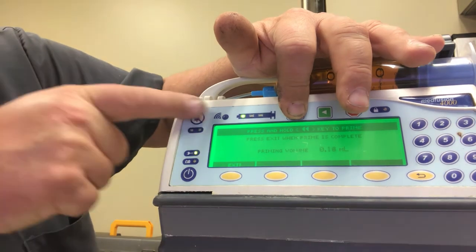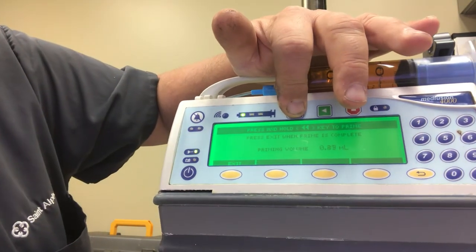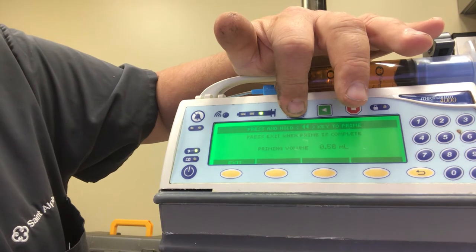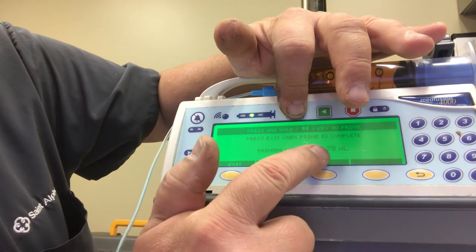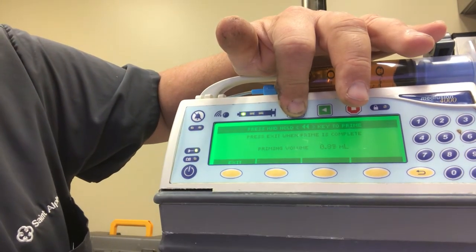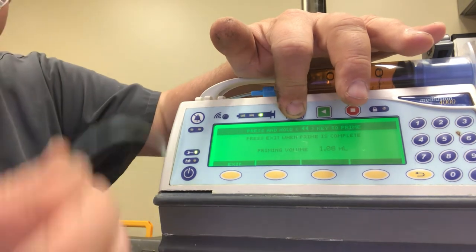This light will also start moving, you can hear it going rar, rar, rar, kind of like that. And it starts counting off how much you've primed and again it's about four mils to prime this tubing.